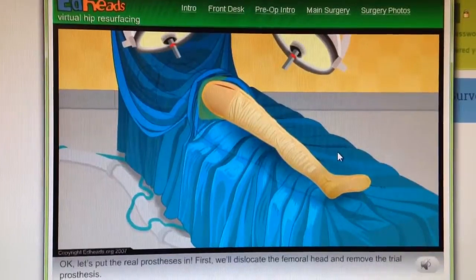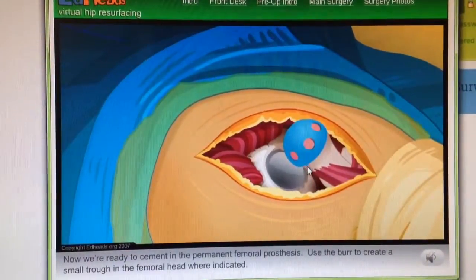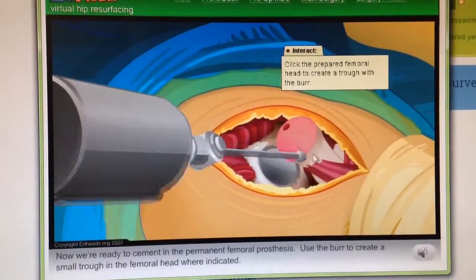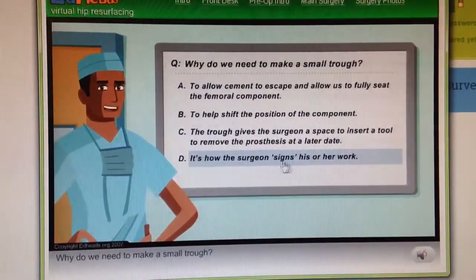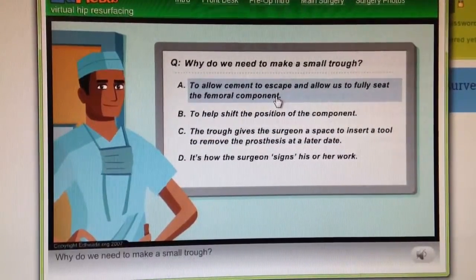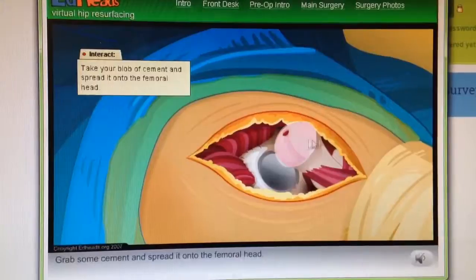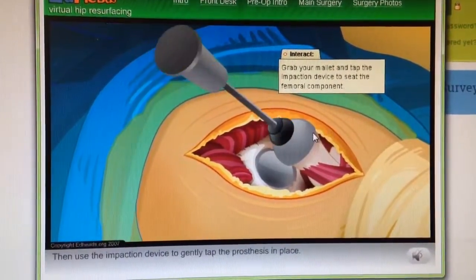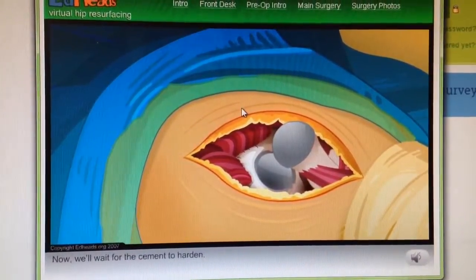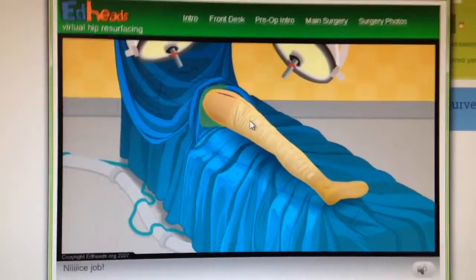It looks great! Let's put the real prosthesis in. First, we'll dislocate the femoral head and remove the trial prosthesis. Now we're ready to cement in the permanent femoral prosthesis. Use the burr to create a small trough in the femoral head where indicated. Why do we need to make a small trough? Grab some cement and spread it onto the femoral head, then use the impaction device to gently tap the prosthesis in place. Now we'll wait for the cement to harden. I will put the hip back into place and check range of motion one more time.